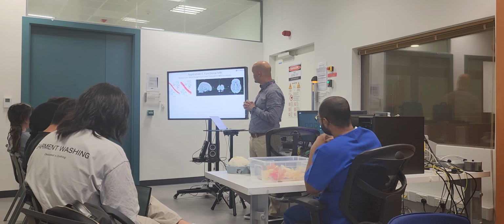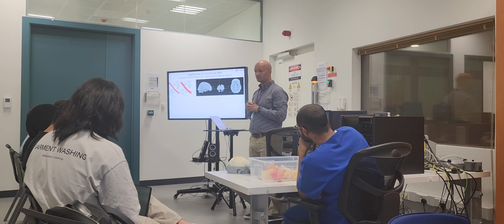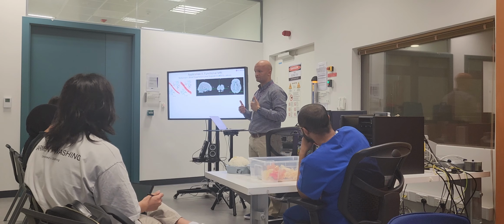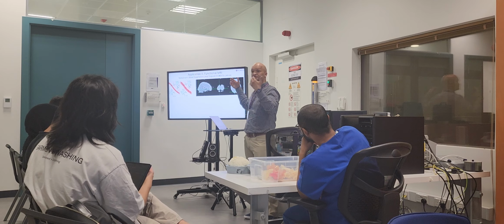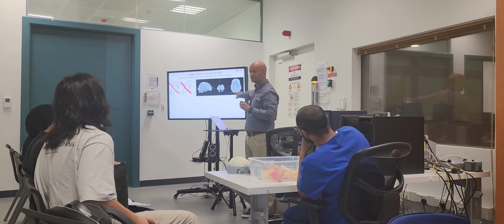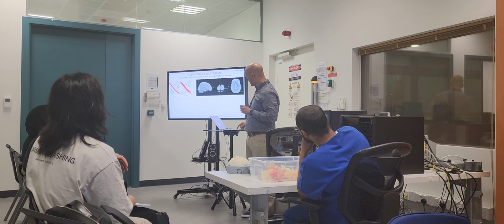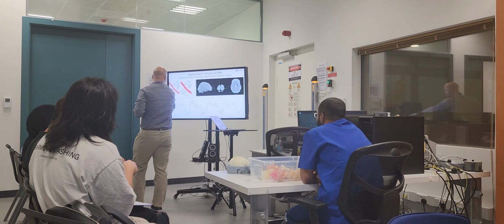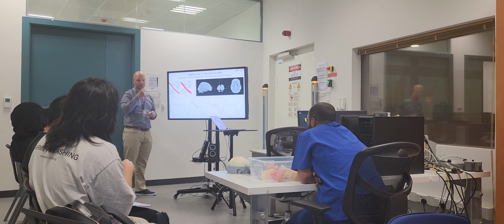Here is a BOLD image. We acquired this whole brain, 72 slices, in 1 second. So it's very fast. That's what allows us to add the temporal dimension, a time dimension. So it's not 3D data anymore, it's 4D data. Look at this voxel here, we call it voxel, not pixel. And look at this signal here. This is time. Every one of those points is a second, a volume.